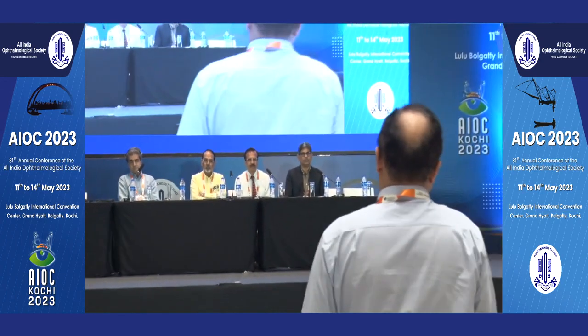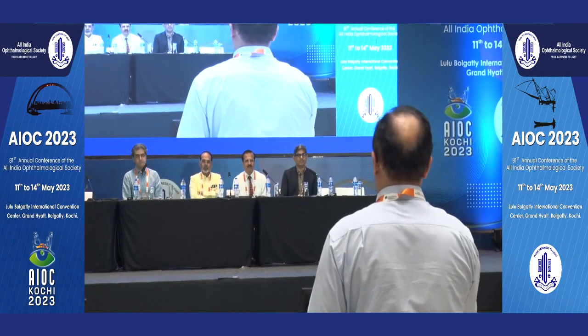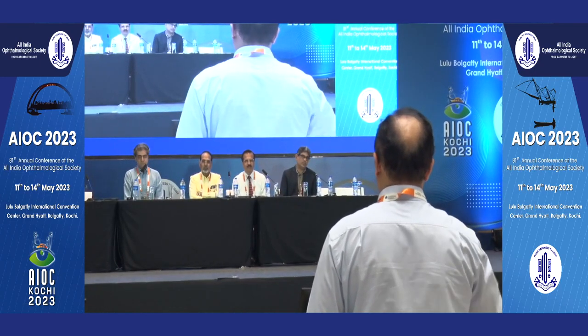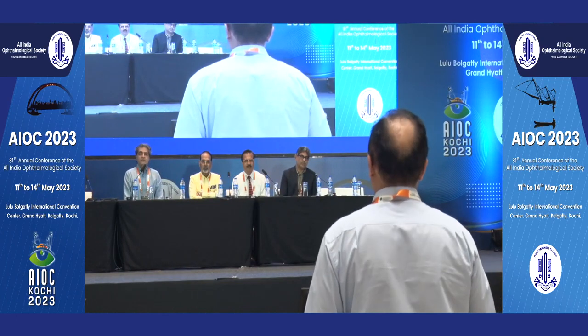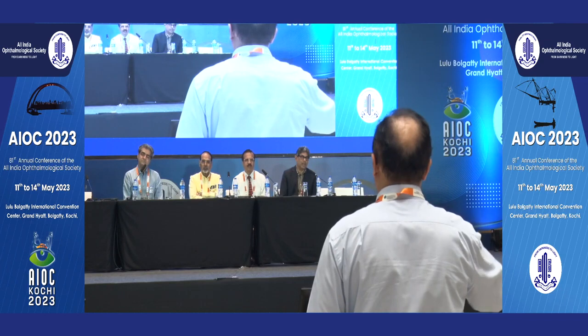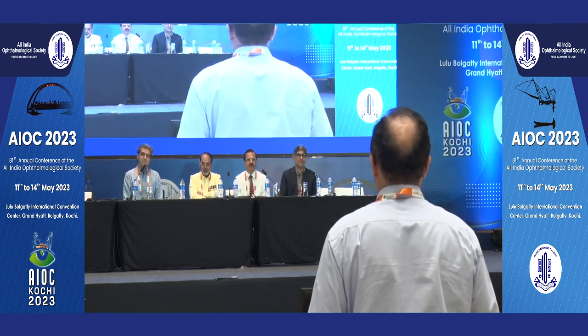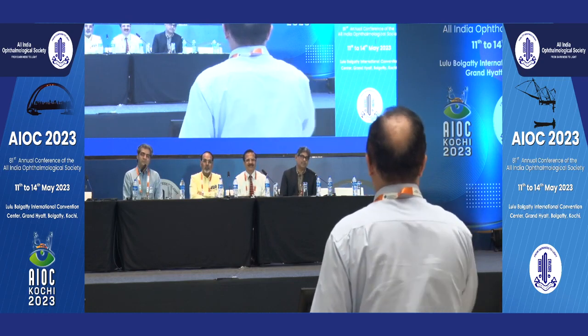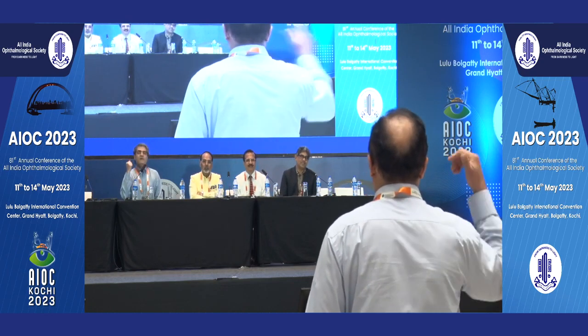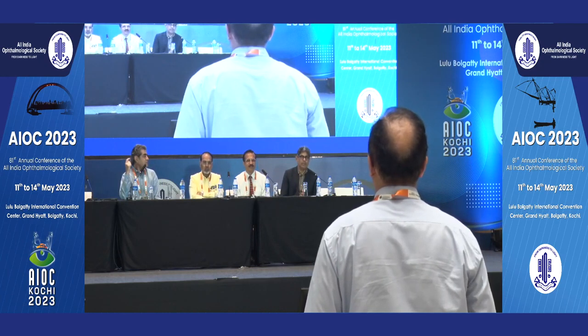You may look at a picture and say, okay, the picture looks fine, and on the table the patient is there, and you're going to put a toric lens, and you're expecting the Z Align to come up, and it just doesn't move. So I've been forced to do a backup marking myself. And fine, that sort of defeats the very purpose of getting a Callisto. It's not giving you a red signal saying that you're going to have problems on the table. I think you should discuss this with the company because this should not happen.